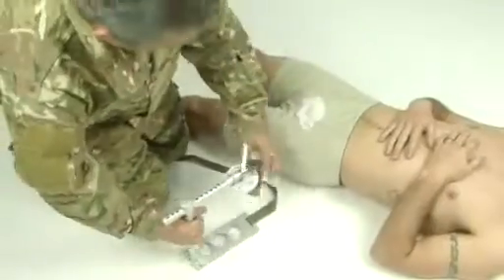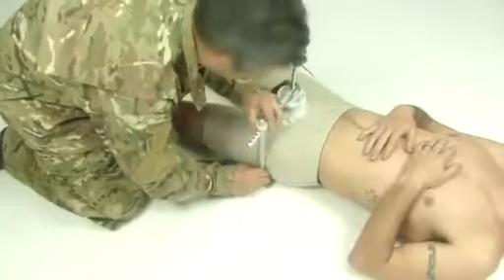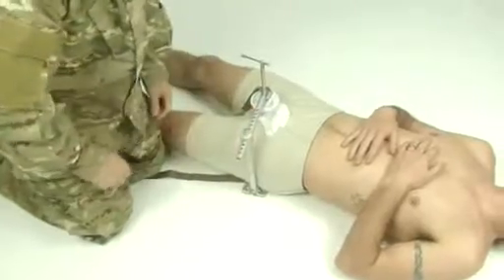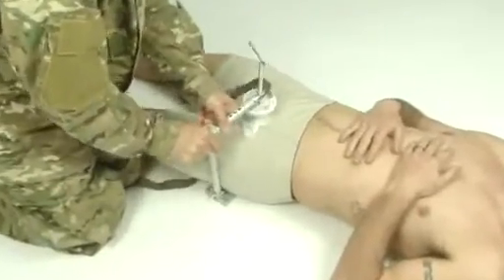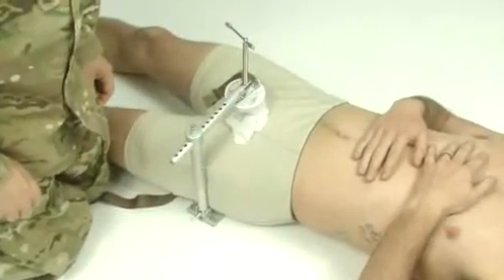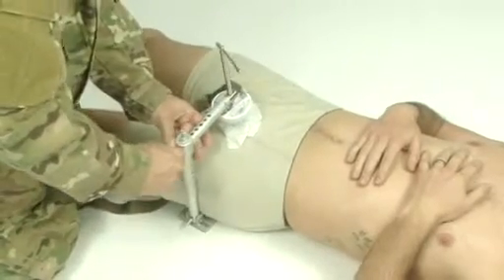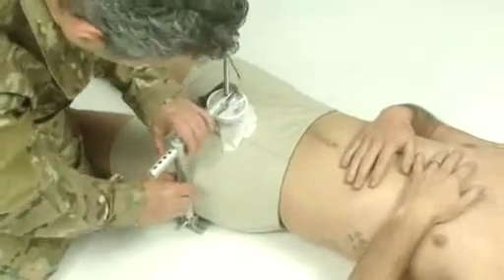Position the base plate under the patient beneath the desired pressure point. Ensure the vertical arm is in contact with the patient on the wound side, in close proximity to the wound location. Adjust the horizontal arm to position the disc head over the desired pressure point. Adjust the vertical arm downward to ensure the disc head contacts the patient.